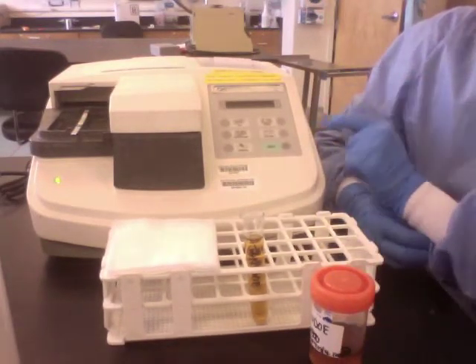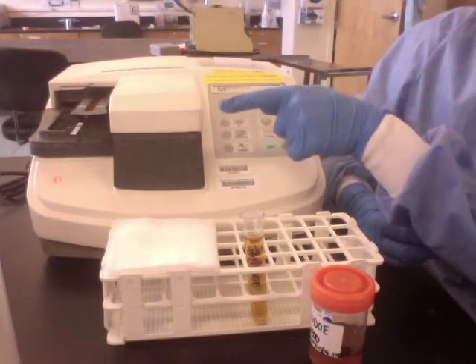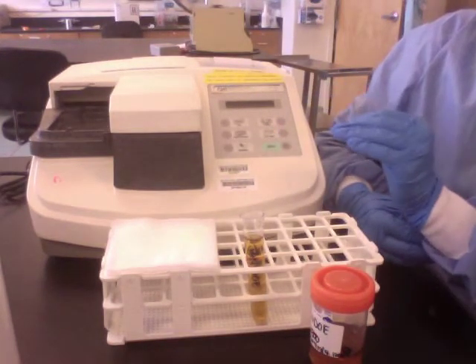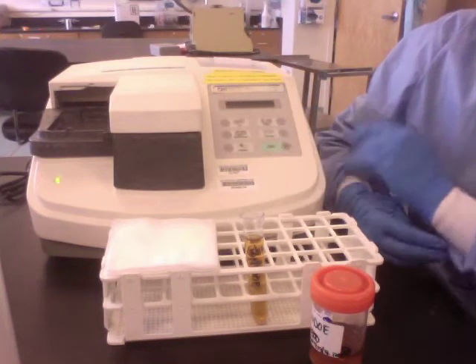Right when you press Start, the screen display says 'prepare strip,' and then it says 'insert strip.' And this whole time, it is timing exactly how long each chemical reaction needs for the correct reading.